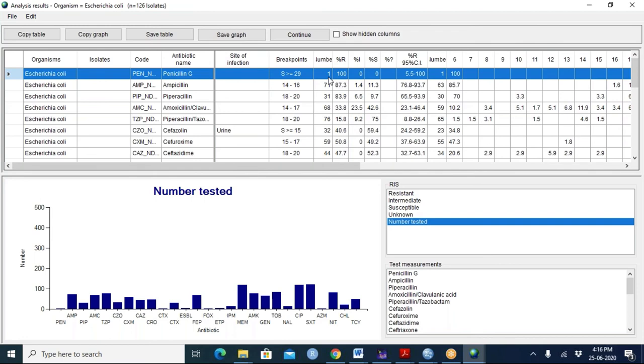So ampicillin is good. PIP is good, but it's an old drug. Nobody really tests piperacillin. Piperacillin tazobactam is very important clinically. Piperacillin by itself, I don't. First of all, I want to make sure. Okay, you do have piptazo. I do see piptazo. So in the table, you see piptazo 76 times. Piptazo is an important drug. Piperacillin by itself really is not very important.